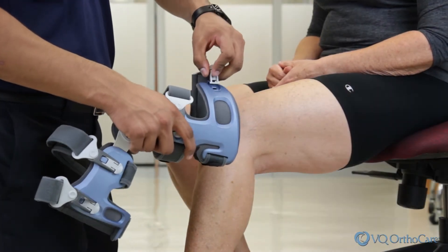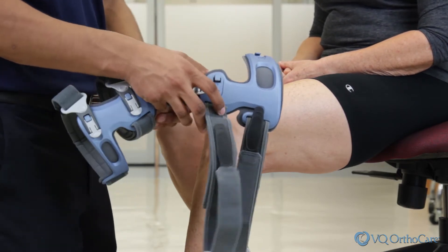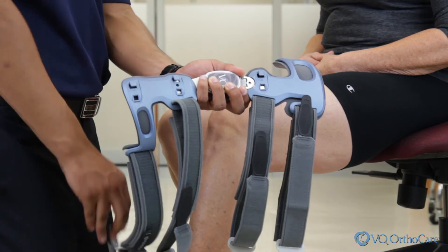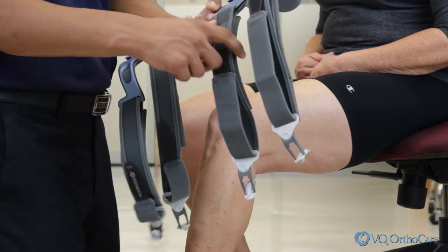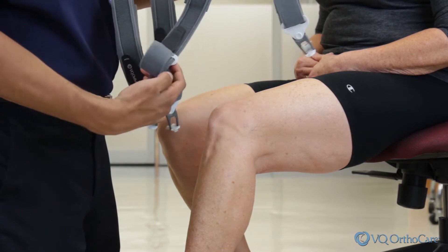Prior to application, open the brace by lifting up on the buckles and unhooking the buckles from the frame. Loosen the straps by peeling up the strap tab and reapplying at the end of the strap.